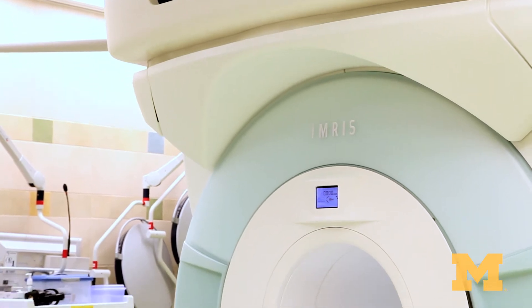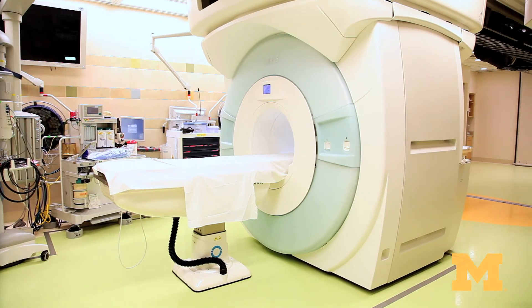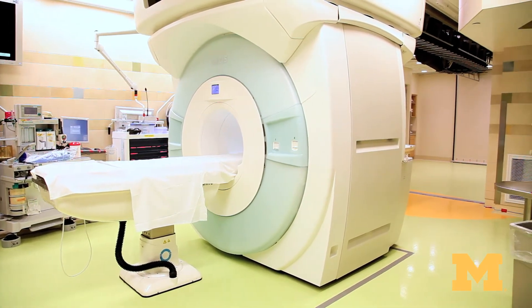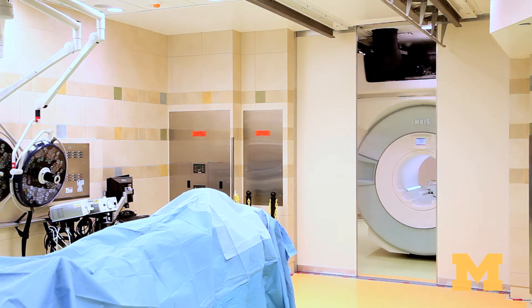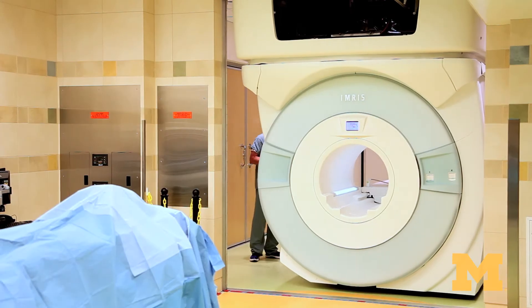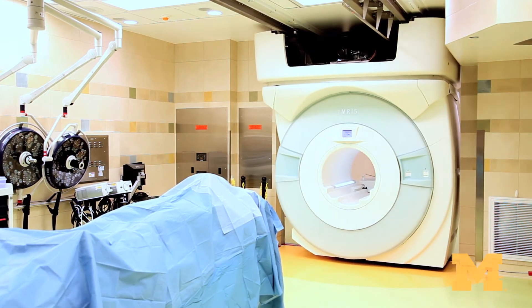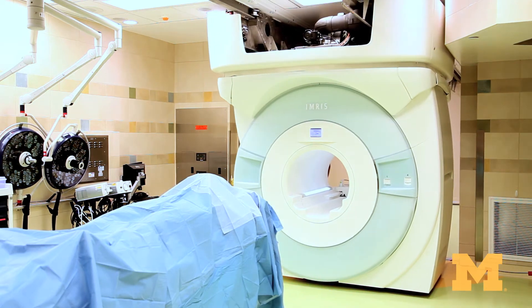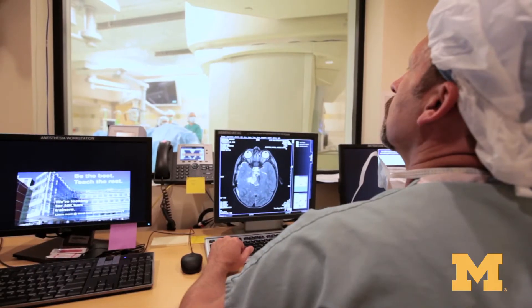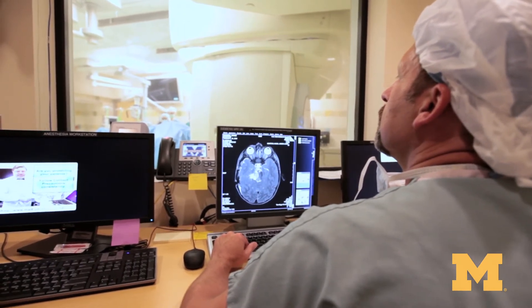What an intraoperative MRI allows us to do is to define, right in the middle of the surgical procedure — right when we need to know that information the most — what's tumor and what's not tumor. The intraoperative MR scanner itself moves into the operating room on an overhead railing, surrounds the patient, and we can obtain the information. Because the patient's operative site is sterile, when we move the MR back out of the way, we can resume operating without delay.